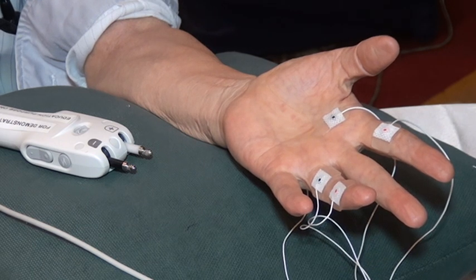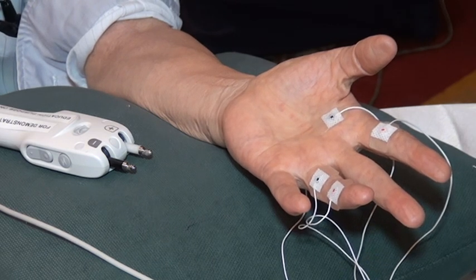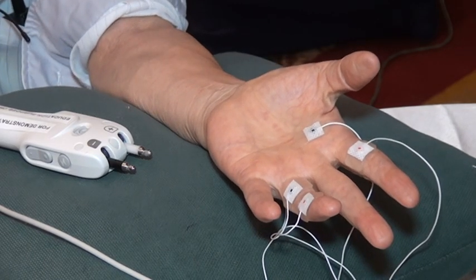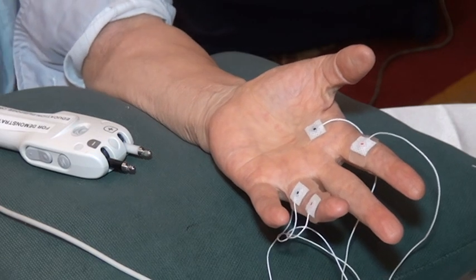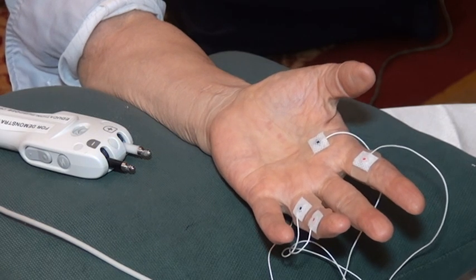And that matches with the ulnar latency, more or less exactly, right? What is this little guy here in front of it? You need to know it so that you can ignore it. But I think it's good if you have some kind of name for it. What is the name here? Motor artifact? Motor artifact due to other muscle activation?